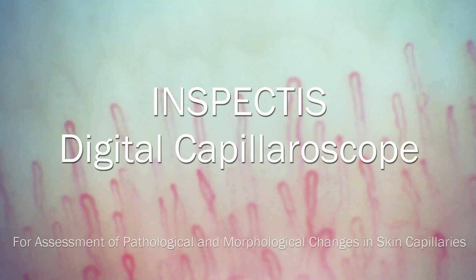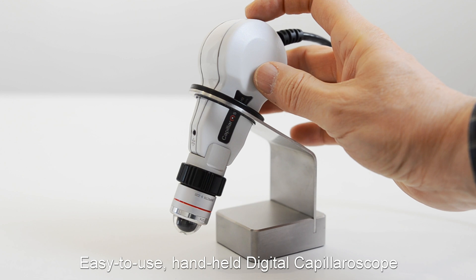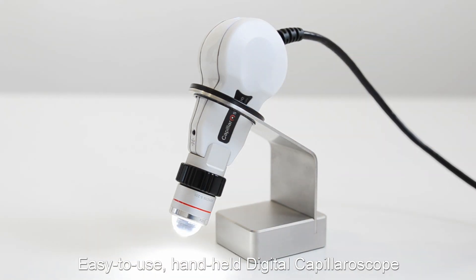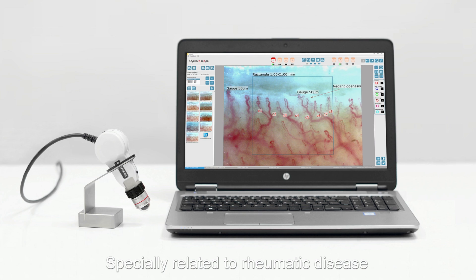Inspectus Digital Capillaroscope — an easy to use handheld digital capillaroscope for morphologic examination and analysis of microcirculation abnormalities, especially related to rheumatic disease.